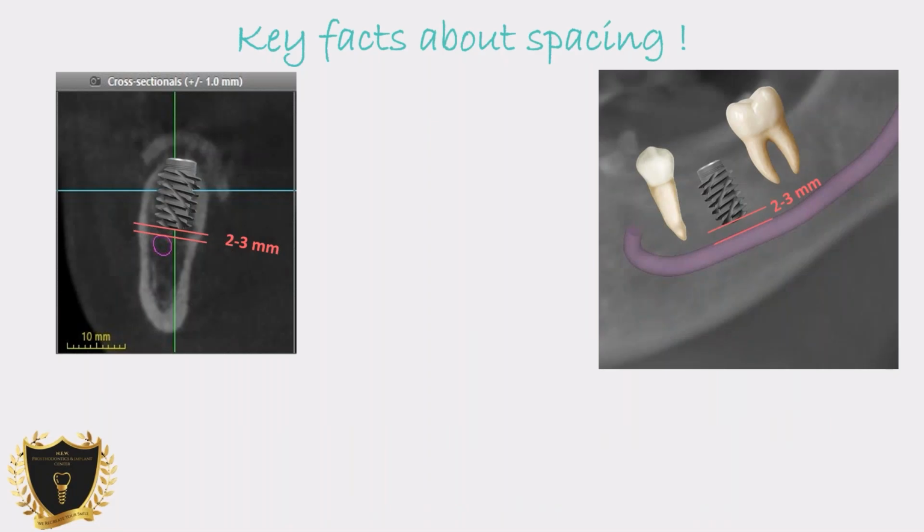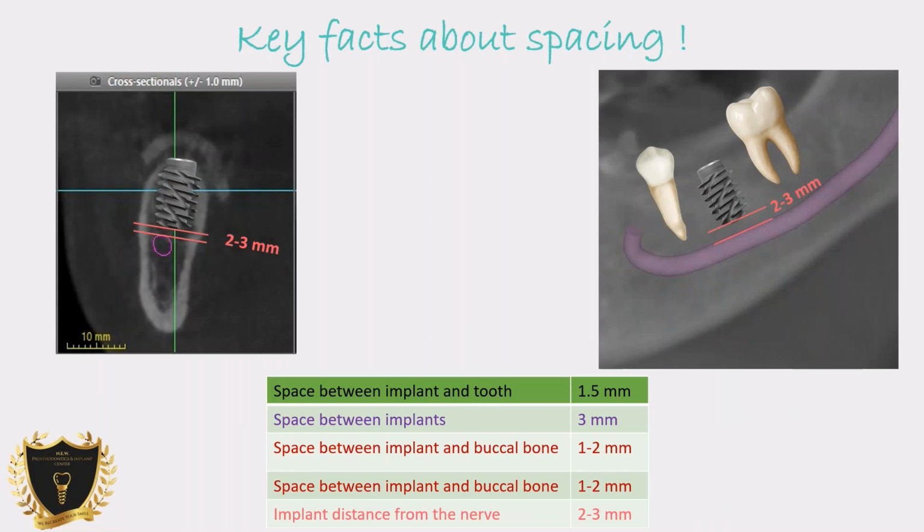Your implant osteotomy burrs have almost a +1 correction. Some have 0.5, some have 0.1. So you have to keep that in mind, that you always have a little more placement risk. 2 to 3, in my opinion, again. So this chart on the bottom gives you all the details which I talk about, and that's a good option for you.